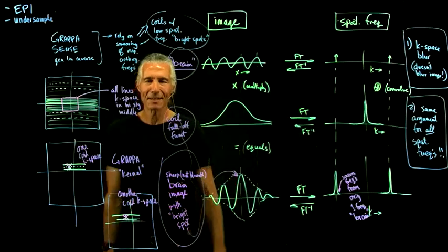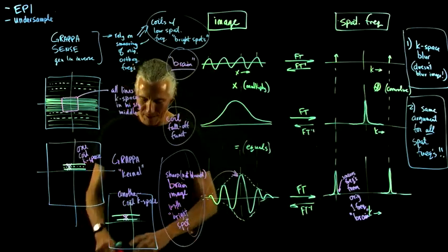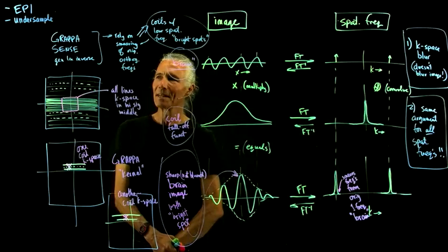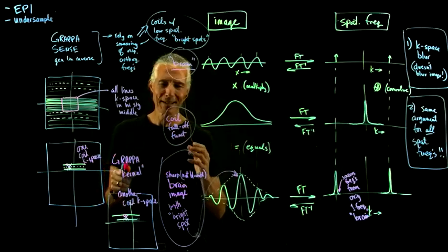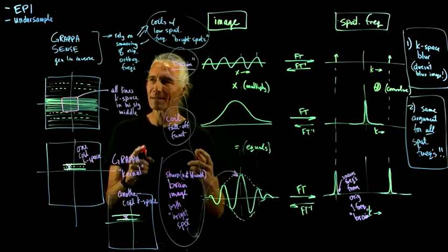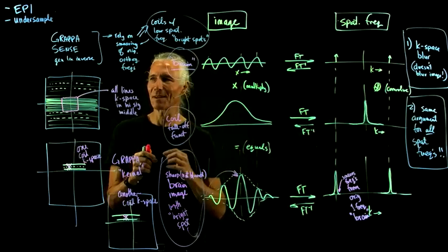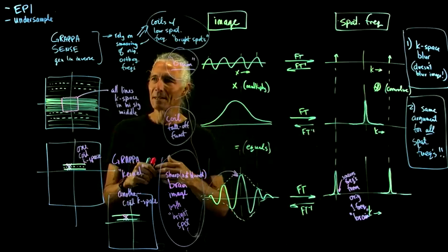Okay, so if you try to read a paper on GRAPPA, you'll see it can be a little confusing, but now this is widely used. Every single day at the scanner, we do an MPRAGE with GRAPPA turned on, and only record half of the data. That's a big difference, because now we get a scan in 5 minutes that used to take 10 minutes, and it looks ever so slightly noisier, but basically it's just fine. So it's like overnight we doubled the rate of collecting data. It's a big effect.